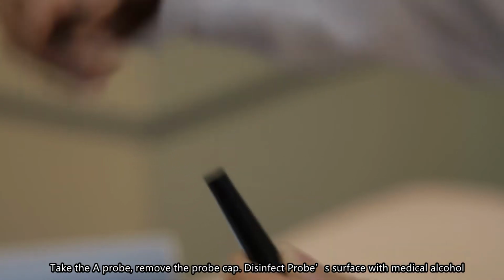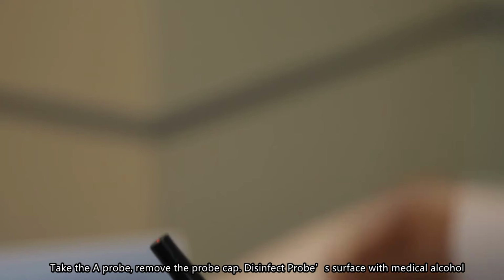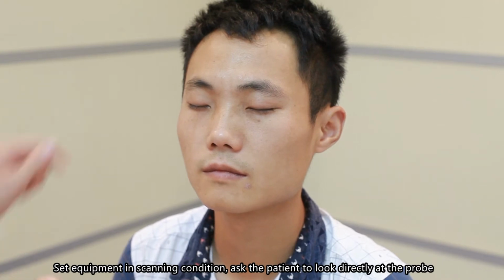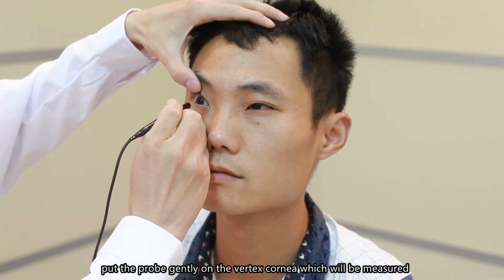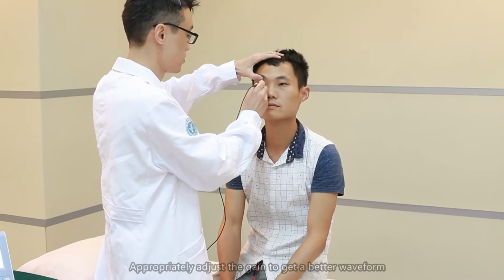Take the A probe. Remove the probe cap. Disinfect the probe surface with medical alcohol. Set equipment in scanning condition. Ask the patient to look directly at the probe. Put the probe gently on the vertex cornea, which will be measured.